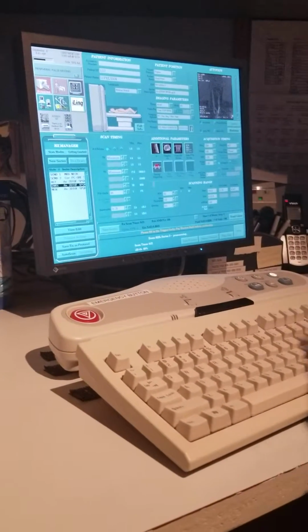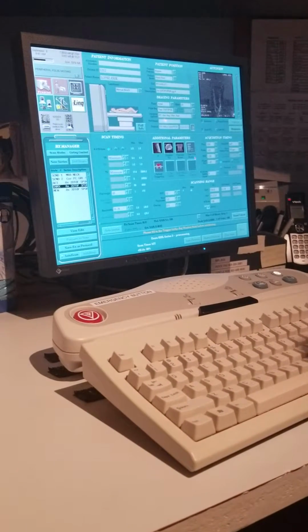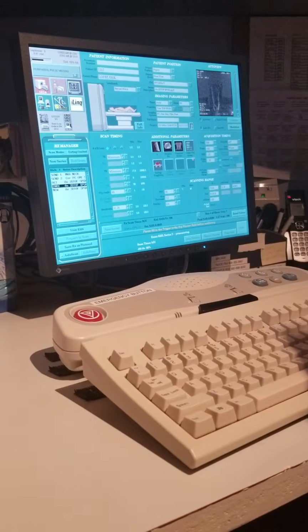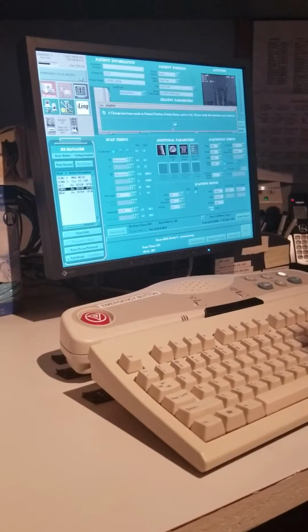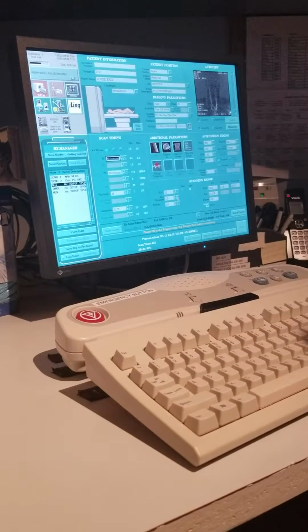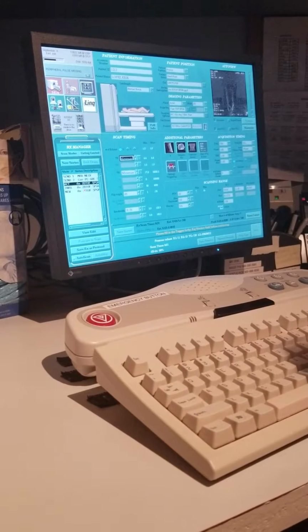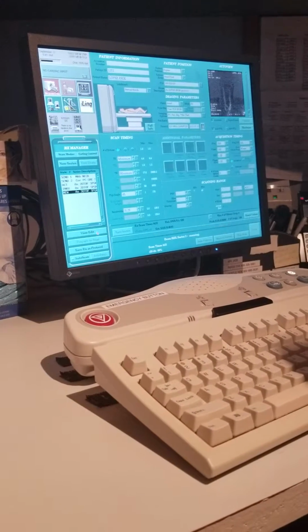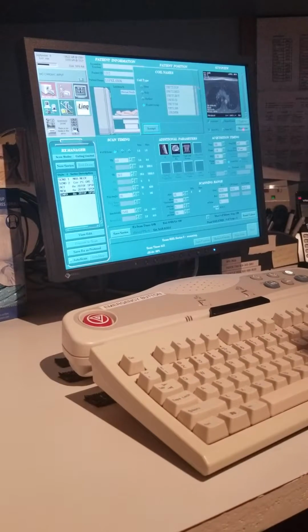Oh, they did a triggering and a gating with the gating feature, which is old school. The gating, peripheral gating. This one. Okay. But just go to the 3D. So just go to the 3D one? So go ahead and maximize.